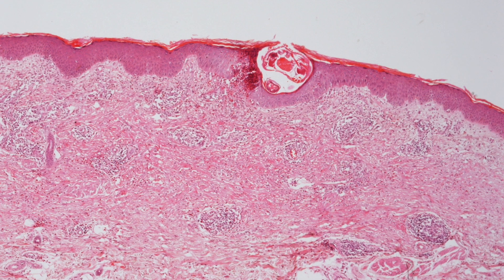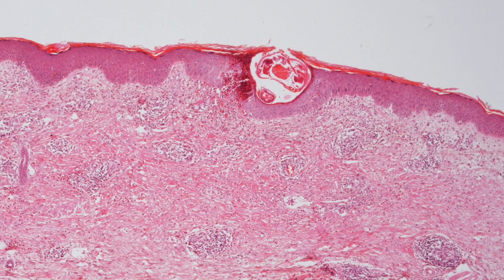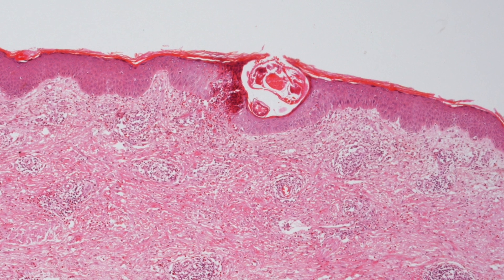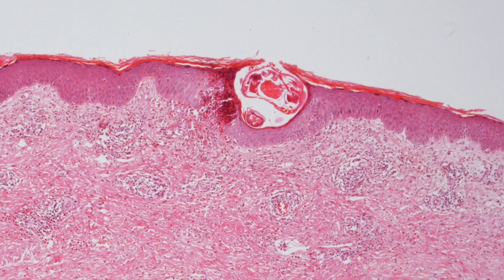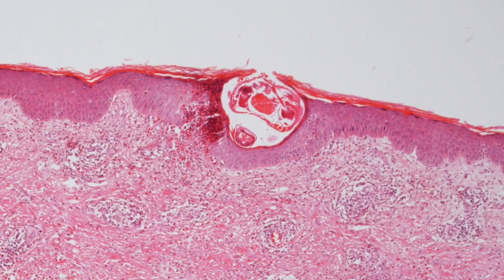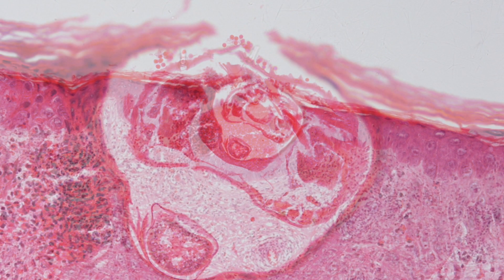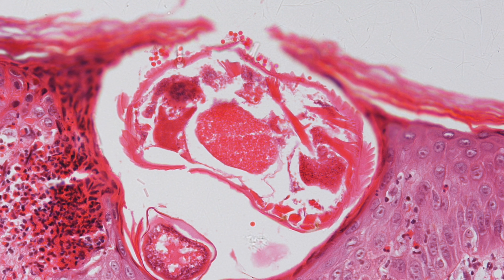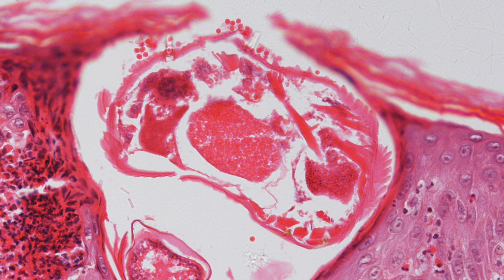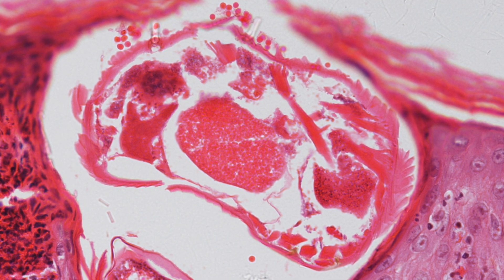This is a low power view of a skin biopsy containing scabies. The obvious abnormality is the hole in the epidermis at the centre of the picture. This is the tunnel containing a mite, and here you can see the corpse of the scabies mite lying in the tunnel that it has created.